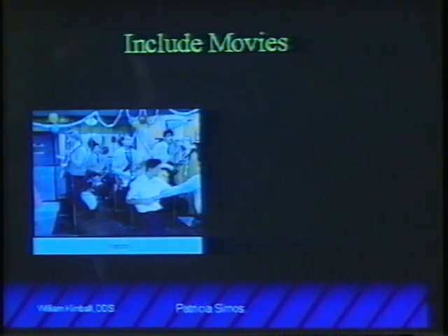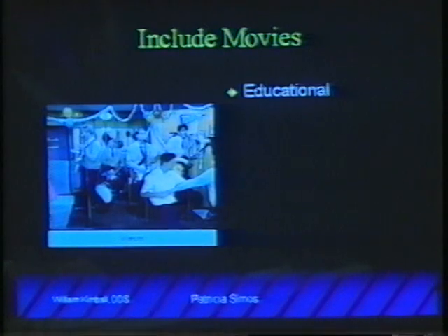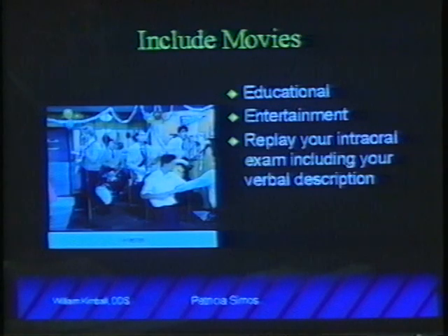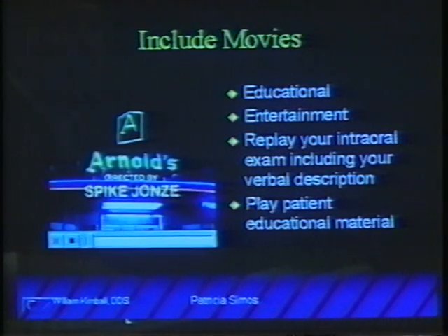You can include movies as well. I'm going to show you some examples of movies which you may not want to use because they're not dental related, but they will illustrate how you can incorporate full motion video into a slide presentation. You can have text which describes what the movie is about. It could be educational, it could be entertainment. You might want to replay your intraoral video tour, including your verbal description. And you can play patient education material. You could easily create your own movies, digitize them on your hard drive, and then play them back when they were needed.